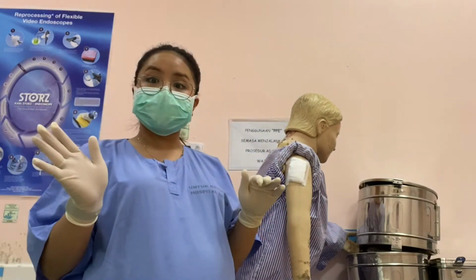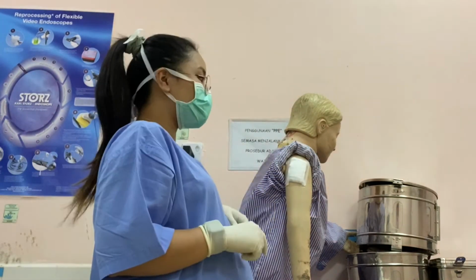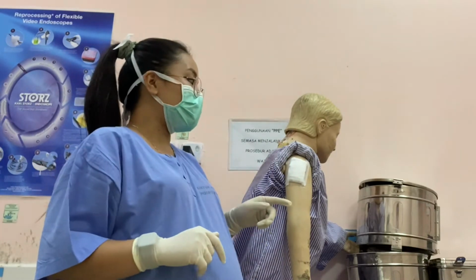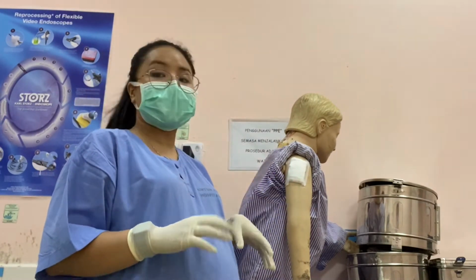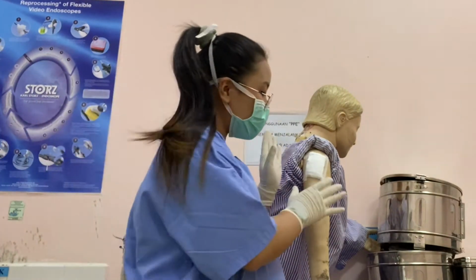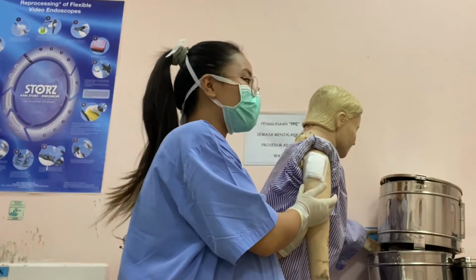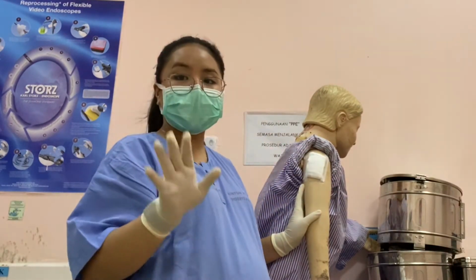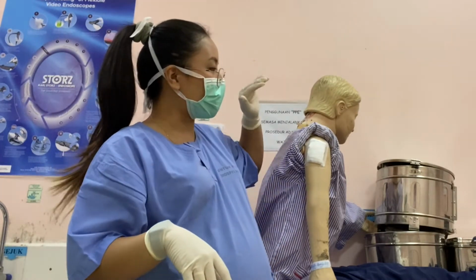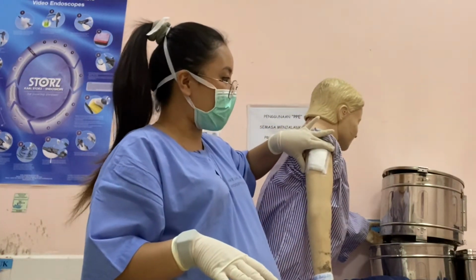Beyond that, you may consider a larger muscle, because the risk of brachial artery and radial nerve damage exists over this site. You can use this site for a 4 year old, but cannot use it for an infant or toddler. It is located at the lateral aspect of the upper arm.